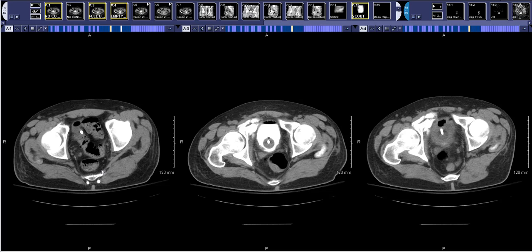For a CT cystogram, if you've never done one, I use the analogy of taking a car trip. When you're instilling contrast, how do you know how much is enough? Typically it's 150 to 200 cc's, but I tell people to imagine you're on a car trip, and as your bladder fills up, I want you to tell me the point at which you would stop the car and pee on the side of the road. That's how full we want it.